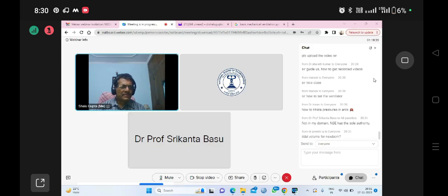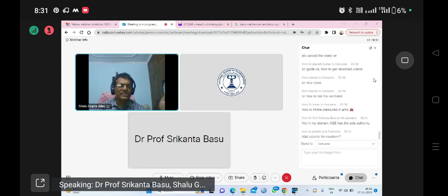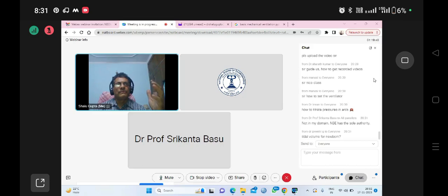Right, so that's happening. And how to titrate pressures in ARDS? I think it's a very important question. Again, you need to define your goals in ARDS. What are your oxygenation goals? What are your ventilation goals? And then depending on your goals, you need to increase or decrease your ventilator settings to target that goal.